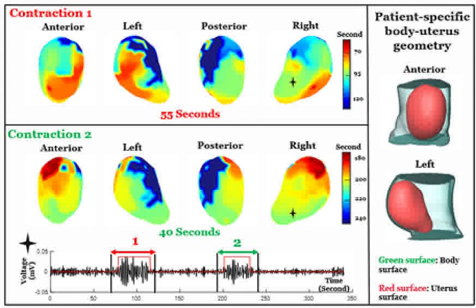Results from the pilot study also bring clarity on a long-standing question on how contractions begin. EMI data suggests there is no fixed, pacemaker-like region in the uterus that initiates labor. The study team observed varied patterns of contractions and metrics among the 10 study participants, with some similarities between women who had never given birth and those who had. However, more research is needed to confirm and expand upon these observations.